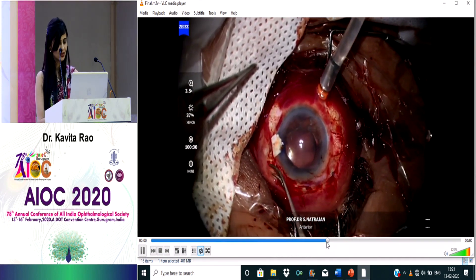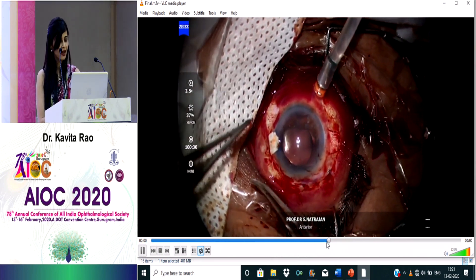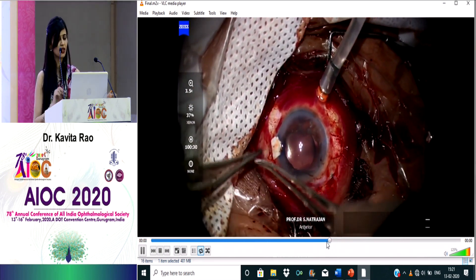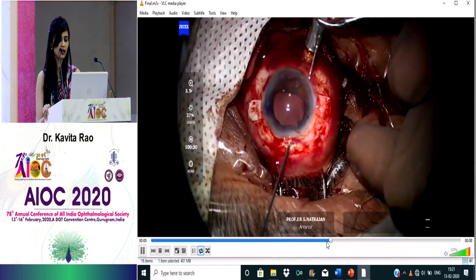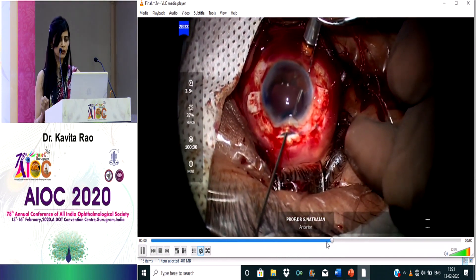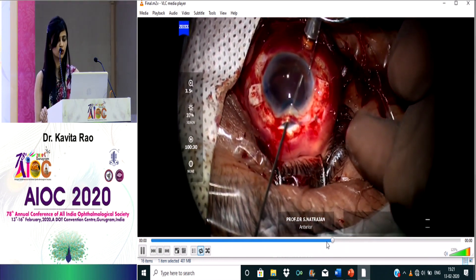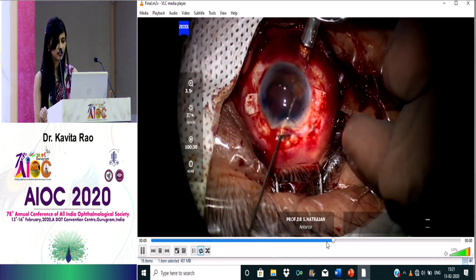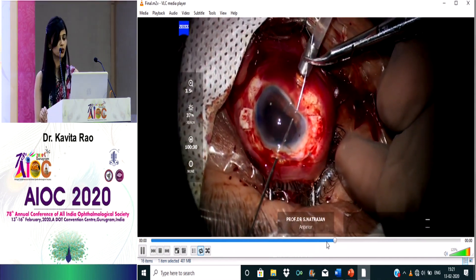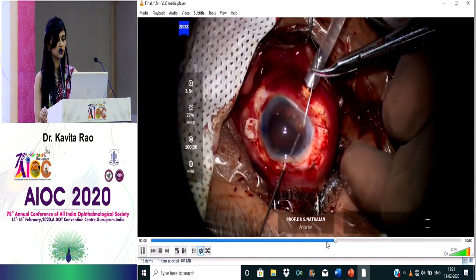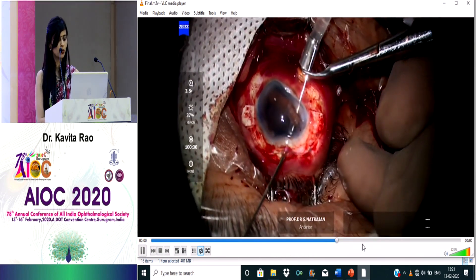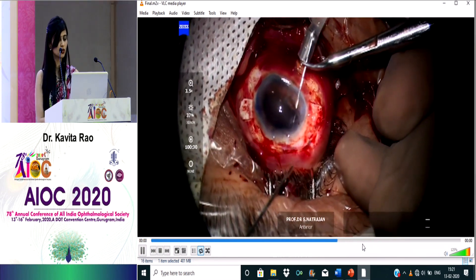The IOL is already in the eye. When tightening the knots on either side, be very careful not to pull too much — that is an important tip. In this case, iris claw obviously cannot be done. We are doing a pupilloplasty here — passing the suture through the clear cornea and then through the iris. You can use an iris forceps if needed to hold the iris.